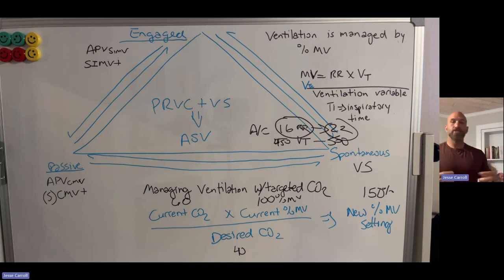So I'd love to teach you guys more about this. I'm going to do some more deep dives coming up into how to choose between CPAP and BiPAP. And you may be shocked at what my answer is going to be, but most of the time you're probably going to want to choose BiPAP. If you're really looking at the patient care tree and recognizing that the majority of our patients that we're interacting with don't just have CHF and they don't just have OSA. They have multiple comorbidities, to include metabolic conditions that are going to be better treated with the support of BiPAP. That's coming up in another video.